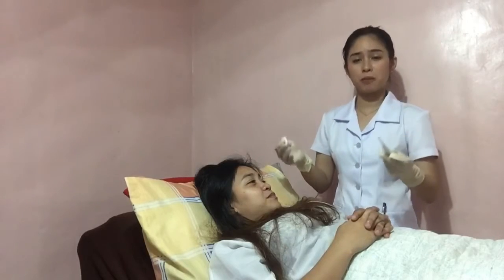So remove the thermometer and wipe the tip of the thermometer using the alcohol swab in a firm twisting motion prior to its placement from stem to probe to lessen the spread of the contamination. So wipe this from the less to the most contaminated area. Also, don't forget to discard the gloves and perform hand washing. Wash the thermometer if necessary and return it to the storage location. Of course, document the temperature to the client's record.